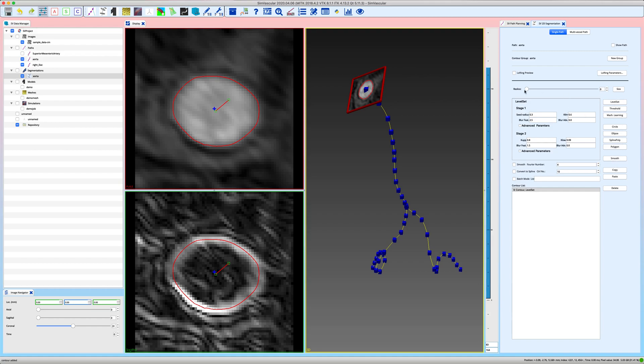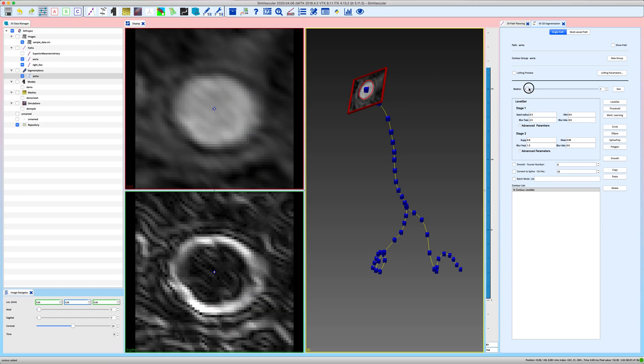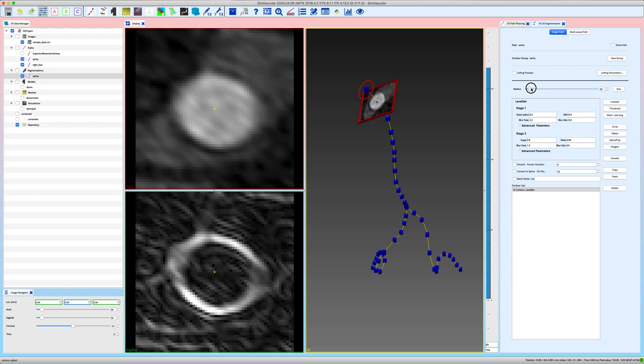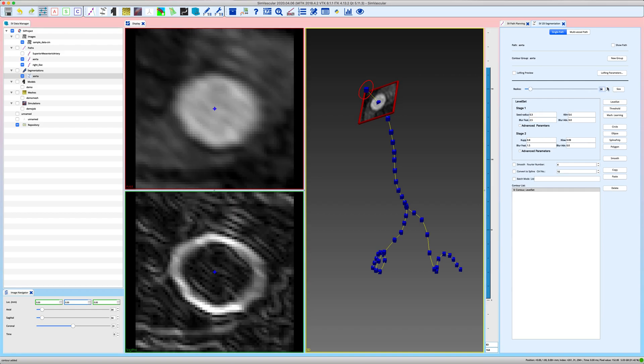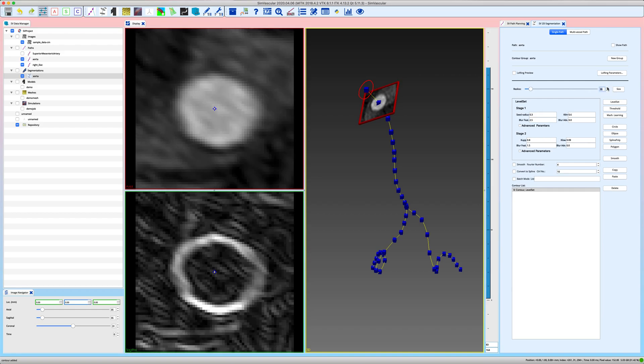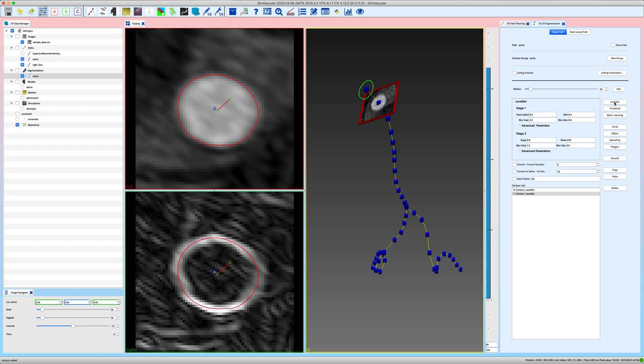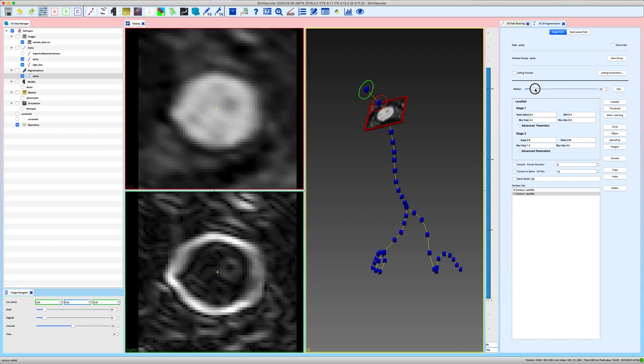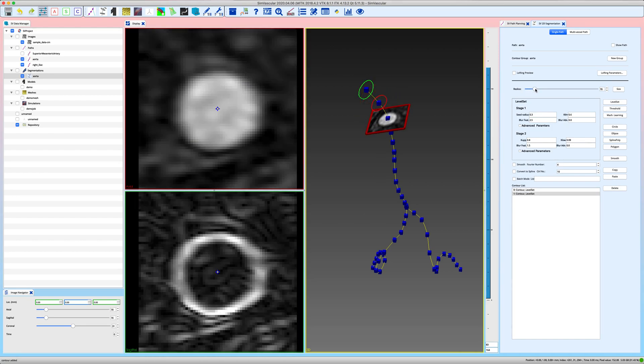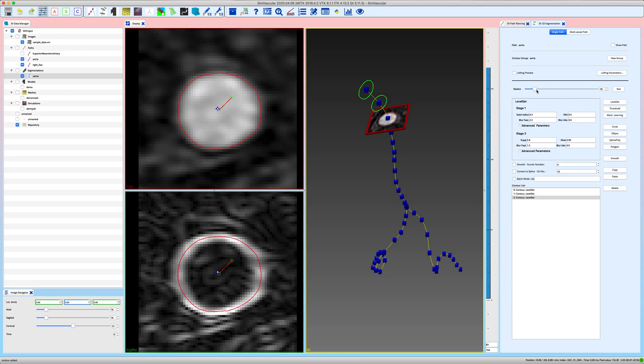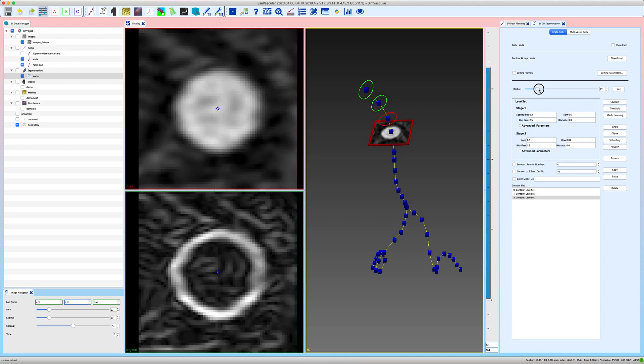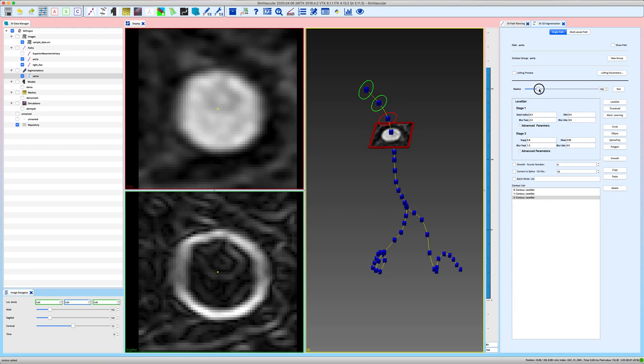And now what you do is you move your reslice plane, the probe plane, to the next location where you want to create a level set segmentation, click on level set again. If it looks good you move on. And basically you can do this just for the whole length of your path and just check out if it works nicely.